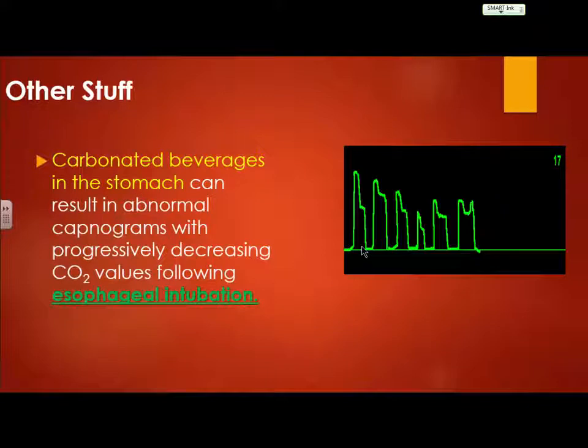All right. So other stuff, of course, carbonated beverages in the stomach can result in some abnormal capnograms. It's going to be kind of far-fetched to see something like this, though. You probably had to guzzle a lot of CO2 to have something that's going to give you any kind of waveform in the stomach, because what does the stomach not do when you push air into it? Yeah. All right.